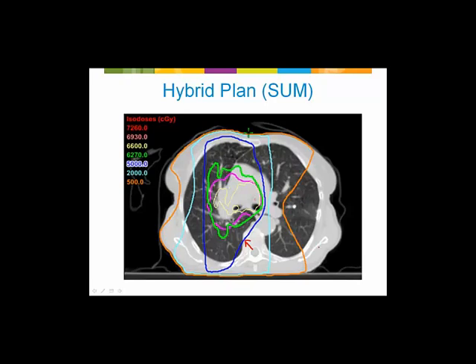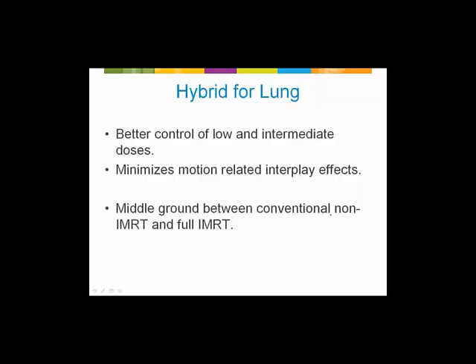Okay, so now I'm going to walk through some details of our planning process at the Simcoe Muskoka Regional Cancer Center and show you some of that. Most patients also receive a PET study as a part of their staging, but our planning is done on the basis of a 4D CT. And all of the 10 phases of the 4D are sent over to Eclipse.